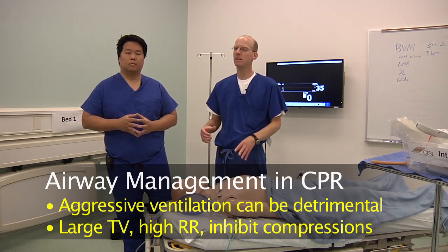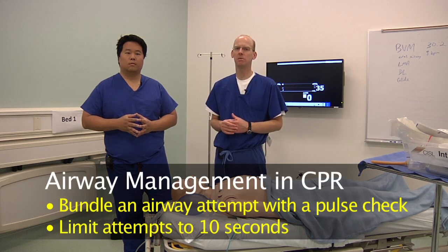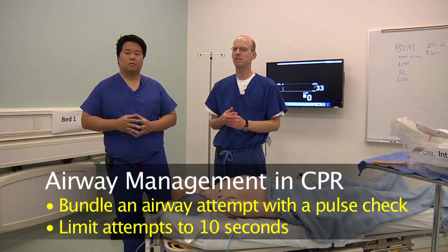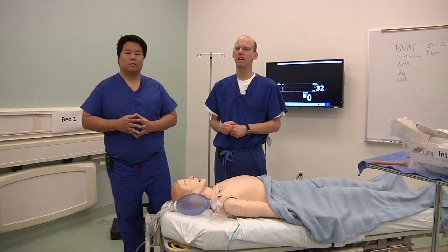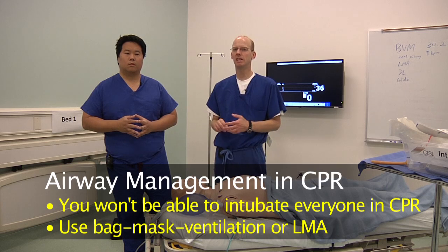We do have some techniques that we can quickly show you on how you can improve things. You can try and bundle a direct laryngoscopy with a pulse check, but like I said, we want anything that's not a compressing event to be less than 10 seconds. It's actually pretty hard to intubate someone in less than 10 seconds. And then they've got to start. They can't wait for you. They've got to start compressions again as soon as they can. So get away from this idea that you're going to intubate everyone in an arrest. Just figure out how to effectively ventilate the patient.